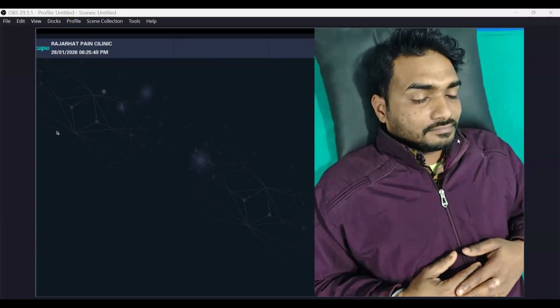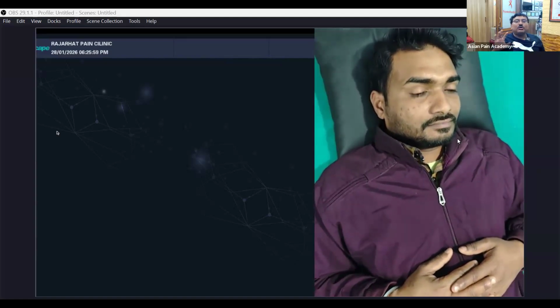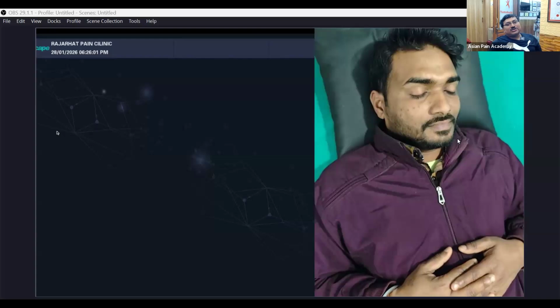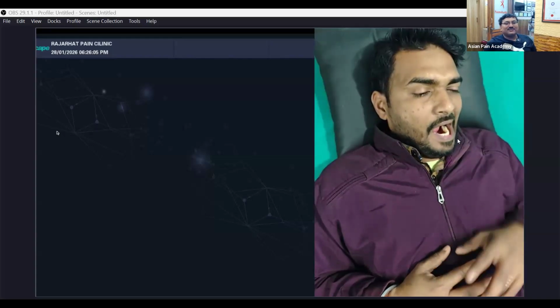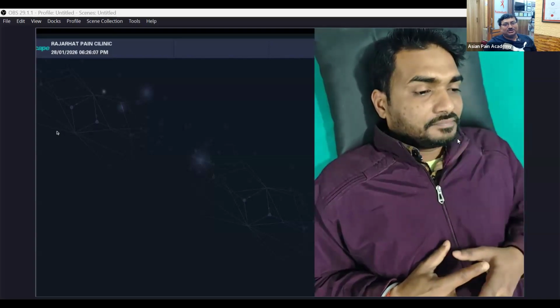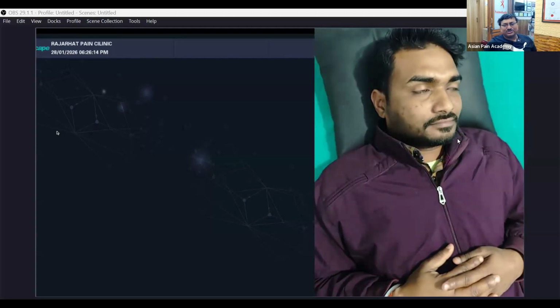Sir, if there is a beard and all that, will the contact of the ultrasound probe not be a bit difficult? That is why you have to use a good amount of gel. Or the other option is you can cut it. No one is preventing you, but it is not necessary every time. So it's your decision. If you can see it properly, if you can do it, because these procedures are very simple procedures, to be frank.